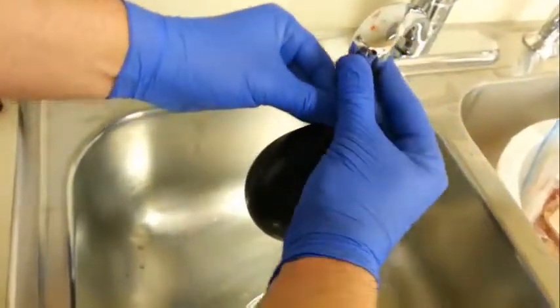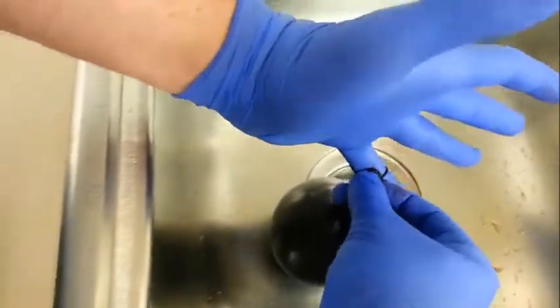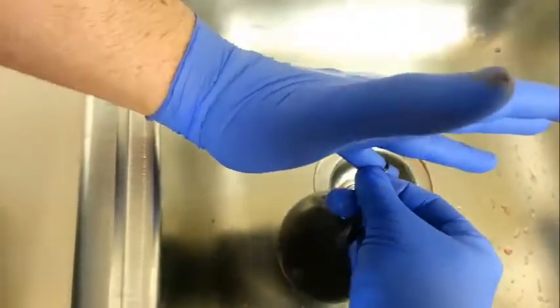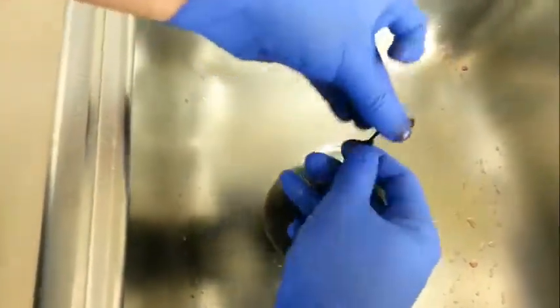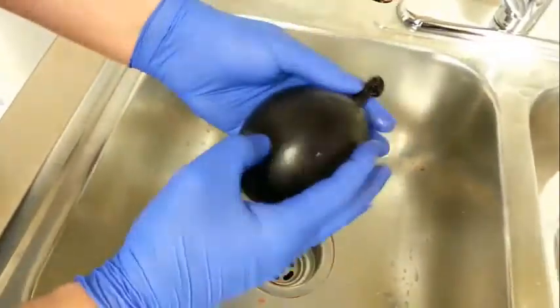Once you've got it twisted down, you can disengage the neck of the balloon. Then, with it still twisted, tie it off. That's what you've got for cardiac size.